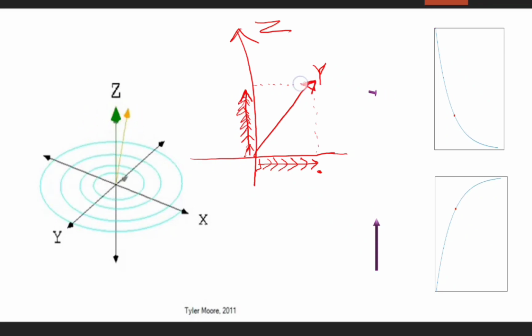So to understand the motion of this vector, this is flipped, this is the hydrogen vector. To understand the motion, this vector is moving from here to here, and when the RF is removed, it goes back. So it takes a spiral path.